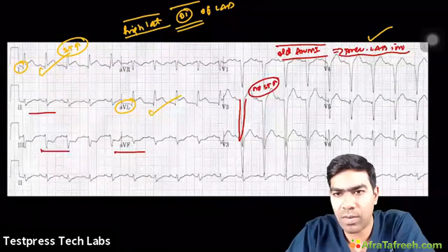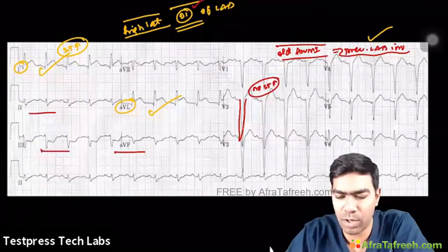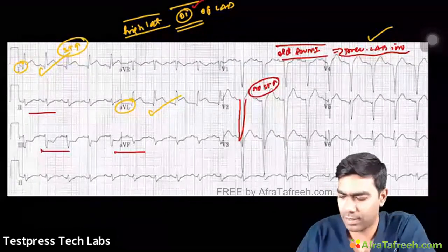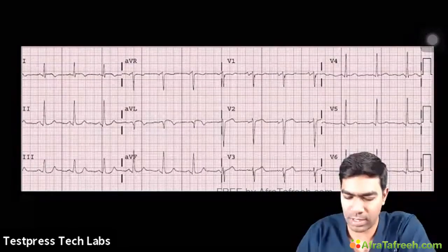So, transanterior MI. I don't know what is meant by transanterior MI. So this is a high lateral MI, should be D1 of LAD. That's all, as simple as that. Diagonal branch, which I've told you already. You can go back and see. So what is this one?